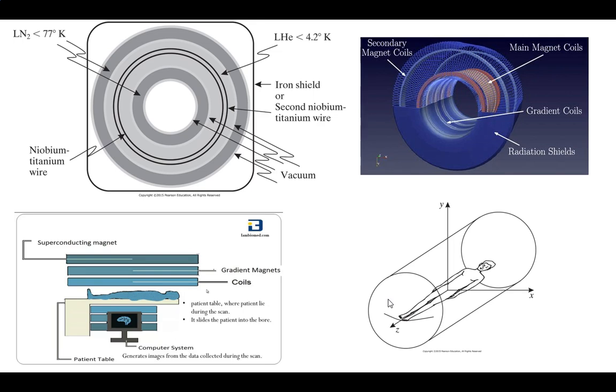And then in a sense, it's like one of those really nice mugs that you get that are metal, but then you have a gap in between. If you have a vacuum or certain noble gases, usually in this case we want all the way to a vacuum. Air or a vacuum is a really good insulator, actually. We tend to think of air as a lousy insulator, but it's actually not if it's not moving.